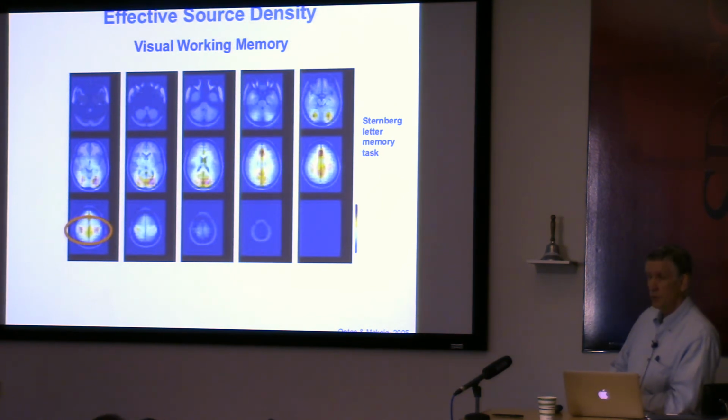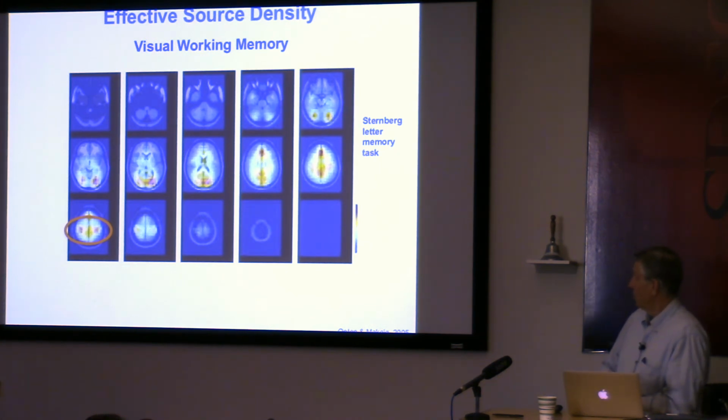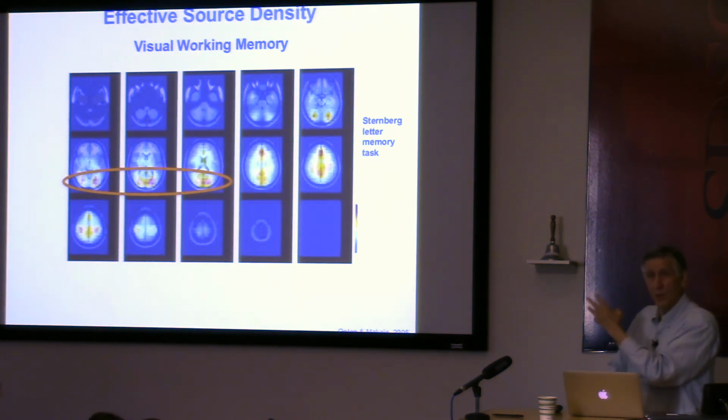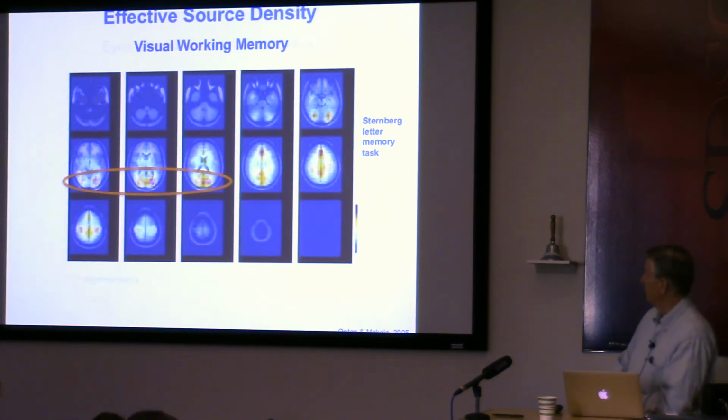We see two hotspots about hand somatic motor cortex. So that means across subjects we find a hotspot there. That means that there is replicability across subjects, even if not perfectly. We see alpha sources, strong alpha sources in the back of the head. Not just producing alpha, of course, but with a strong alpha peak in their spectrum.